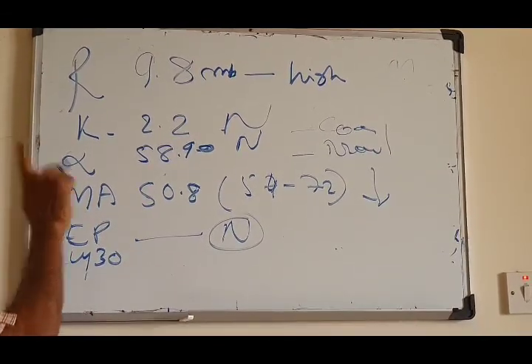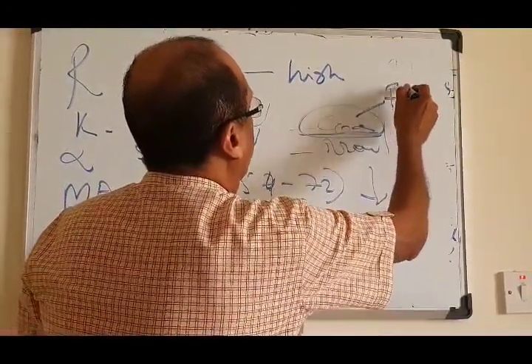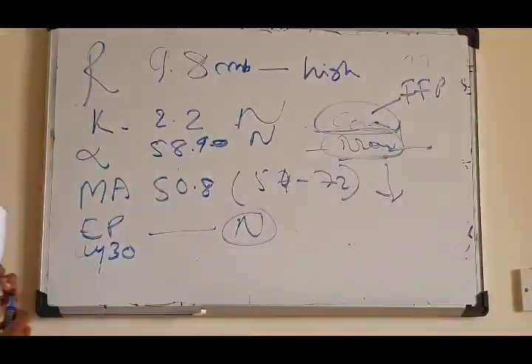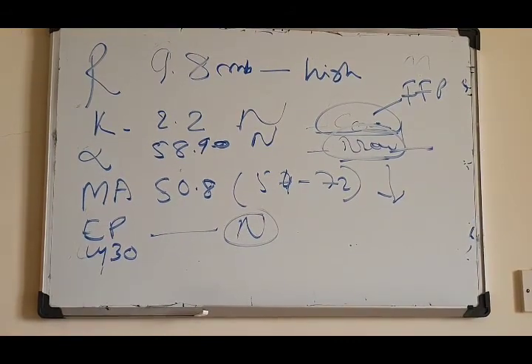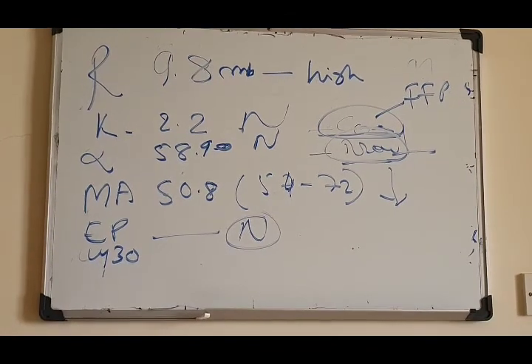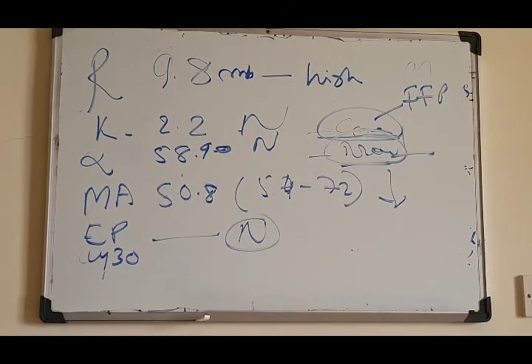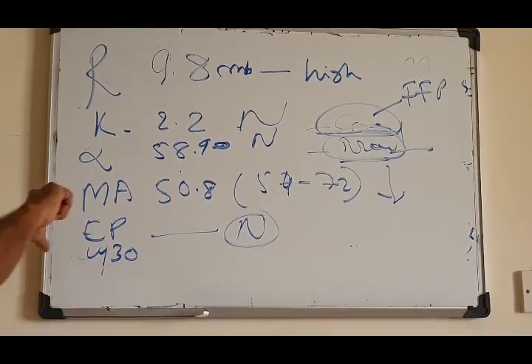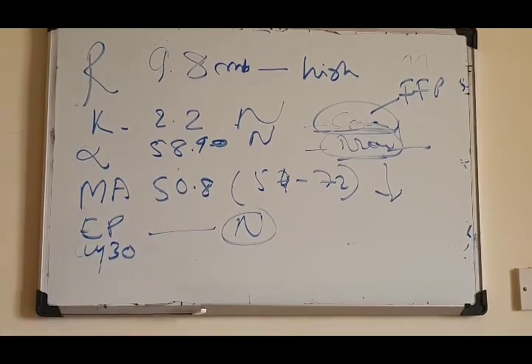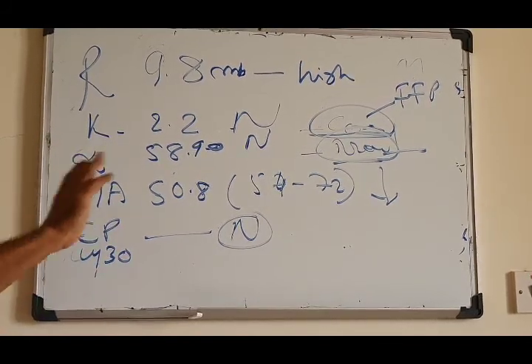So in this patient, if he is bleeding, he needs a coagulation factor replacement by either FFP or PCC and platelet transfusion to improve the maximum amplitude. This is how the TEG helps you in a bleeding patient. This is especially very useful in a trauma center where a traumatic bleeding patient is brought to the hospital. You don't know what component of the therapy to be given. Immediately transfer the blood to the TEG machine or the ROTEM machine. You will get the result within 30 minutes, and then you can assess the component therapy.